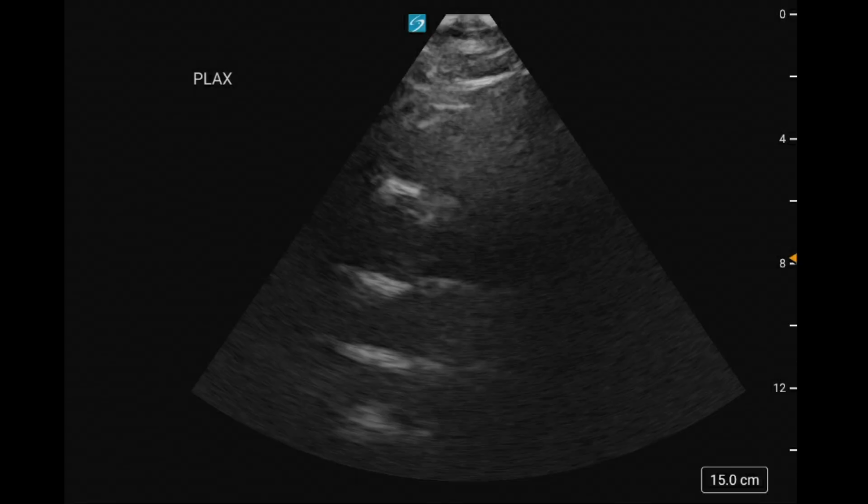So case one is a woman in her 60s who has a history of cancer, unfortunately, and had metastases to her lungs. She was managed with an indwelling pleural drainage catheter because of recurrent pleural effusions, and came in because she was concerned for catheter complication. She had some leakage around the catheter and was complaining of some shortness of breath as well.